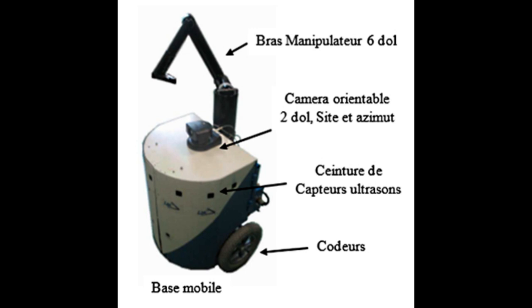We have opted for a semi-autonomous mobile manipulator robot that assists the disabled person in moving and/or manipulating objects. The term assisted is ambiguous and needs to be clarified. From the robot's point of view, the term assisted implies that the robot has autonomy functions that enable it to perform certain tasks only partially and that the user must assist it.